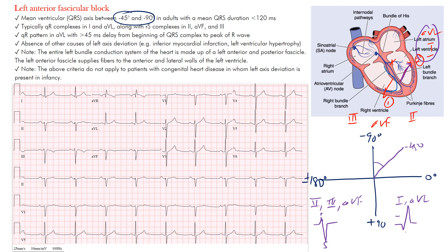This is where you see rS complexes in the inferior leads and qR complexes in leads I and aVL. Looking at the EKG here, in lead I and aVL you can see the q wave followed by the big R wave, and in lead I there's a qR followed by a small s. The main finding we're looking for is the axis deviation, and in the inferior leads — II, III, AVF — we're looking for those rS complexes.